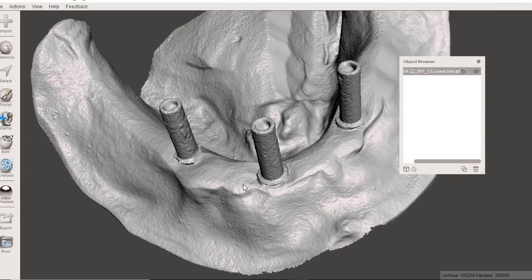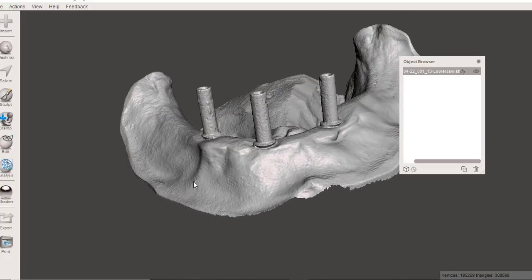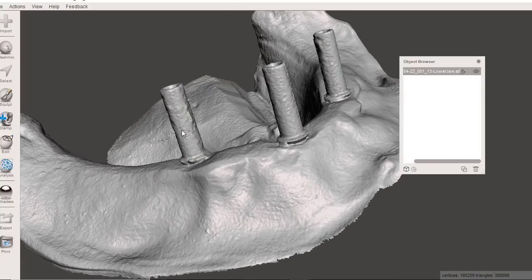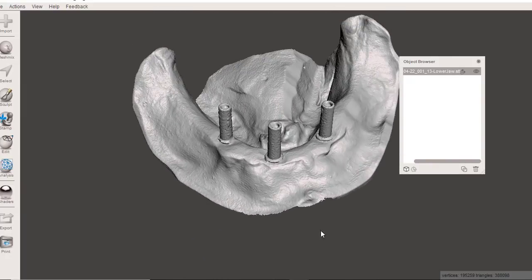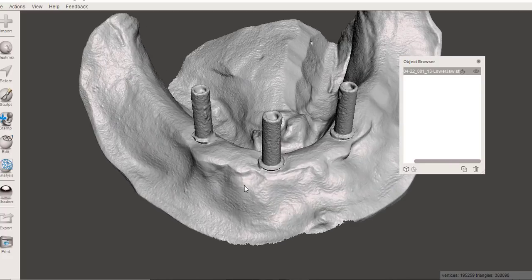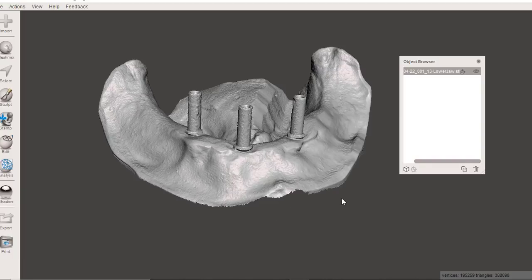Okay, so I've scanned in the model that had the UCLA abutments on this, and I'm going to take a little bit different approach as to how I make the bar framework going across here. You could absolutely just do some spans of pattern resin across here and wax directly onto your model, making the resin pattern that you're going to cast. But I thought this would be a cool option to do it in a 3D printed resin and just show you some of the functions there that can expedite this, make it a little cleaner.